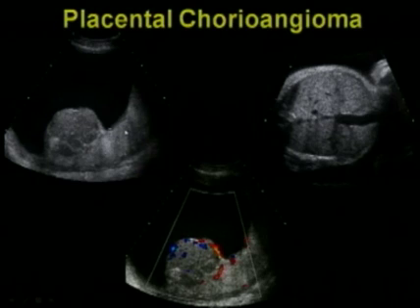And here's another chorioangioma. There's the end of the placenta, a large chorioangioma, with a fair amount of blood flow. They can lead to fetal hydrops in some cases. And here we see the early phase of hydrops, which is a dilated umbilical vein. And this is due to vascular steal phenomenon through the chorioangioma.